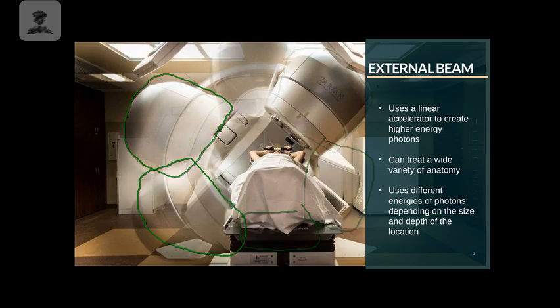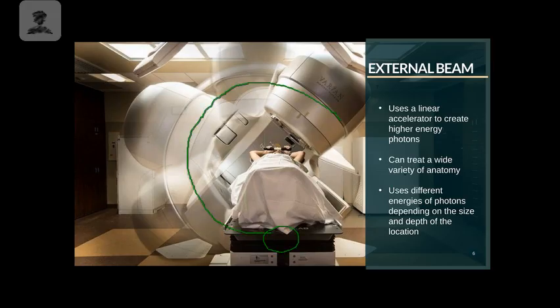So it can only rotate the 360 degrees and then it has to rotate back. So it's not like an unlimited, just spin the wheel and it can continue to go. If it started here, it can only make itself all the way around and then the gantry head would stop here and then have to go back the other direction.